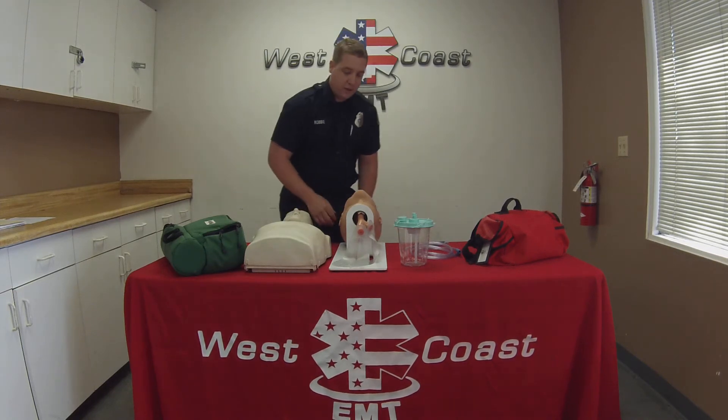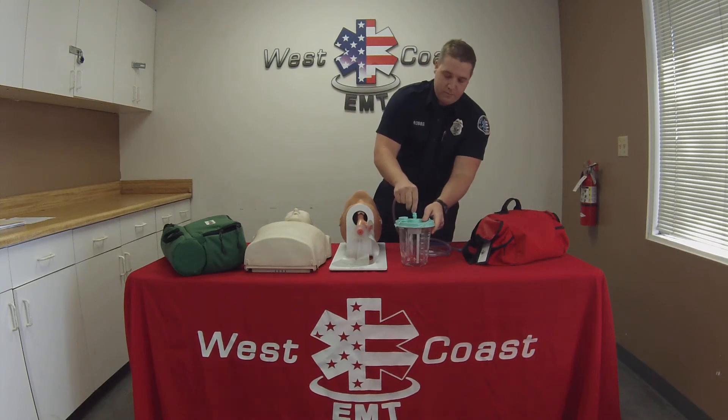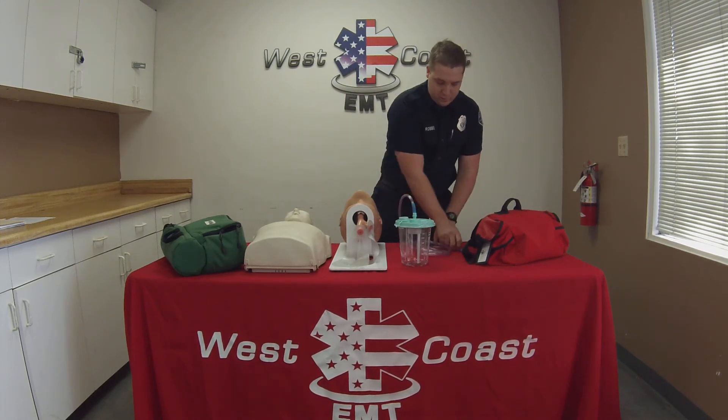I'm going to go ahead and check my patient's airway. I'm going to use the head tilt chin lift or the jaw thrust maneuver, whatever the situation calls for. Do I see anything or hear anything? The mouth is full of secretions and vomitus.